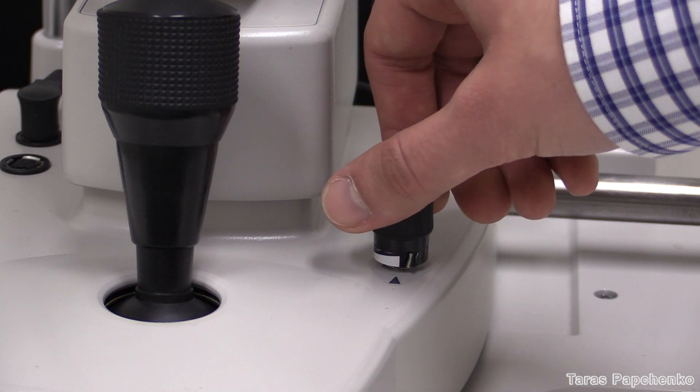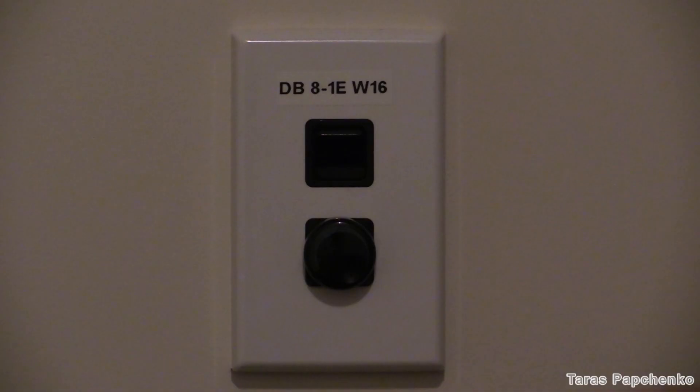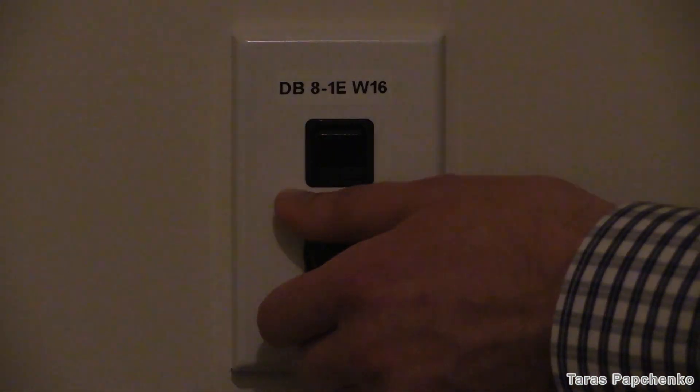Turn the brightness of the slit lamp onto maximum as you will need good illumination. Dim the light in the room before you take a picture, otherwise you're going to get an unwanted reflection of yourself in the image, like on this one.